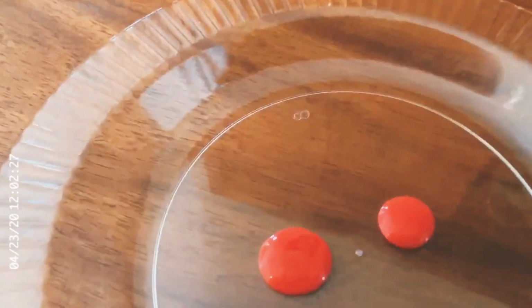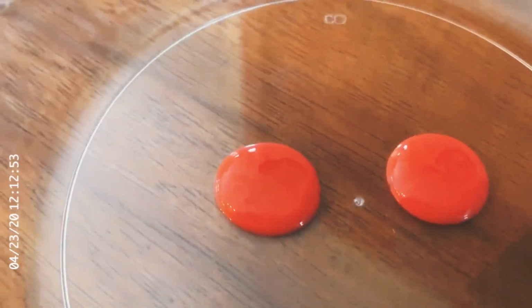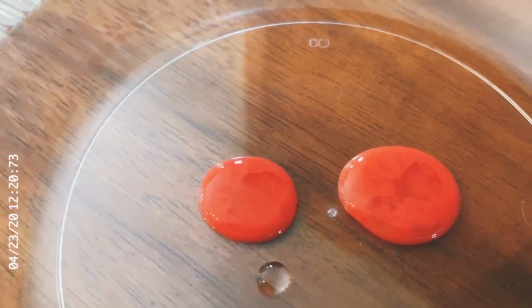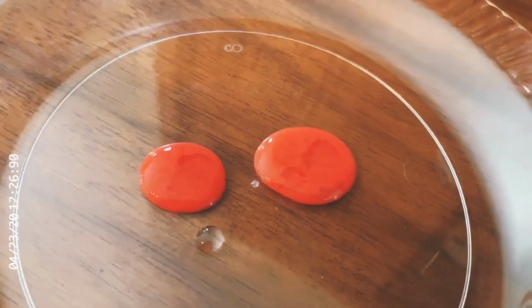Anti-B. Take note, or I'm sorry, that's anti-A. Take note of what it looks like. And then we'll go ahead and do anti-B. Take note of what it looks like. I'm gonna add a little bit more anti-B just so I can be sure that you can see the results. There we go. Positives and or negatives for Jen. Go ahead and write those down.